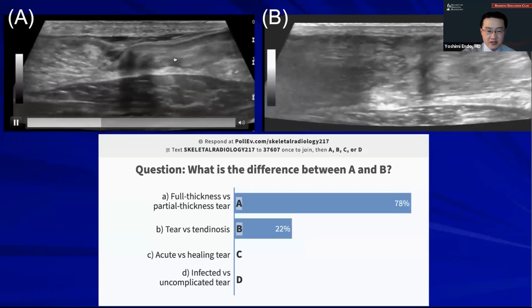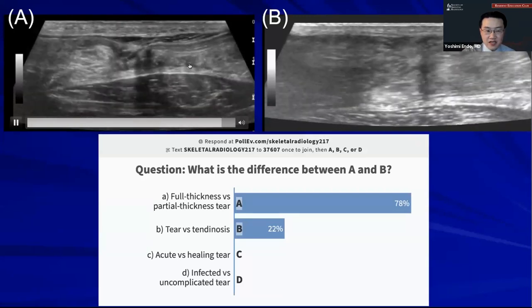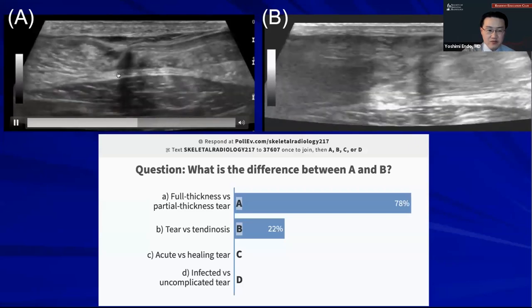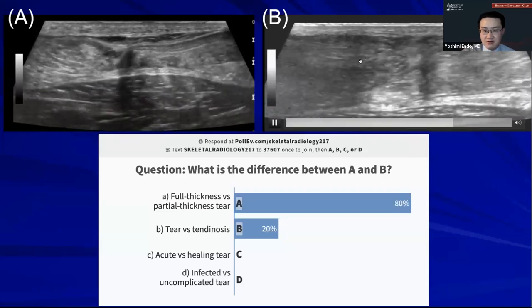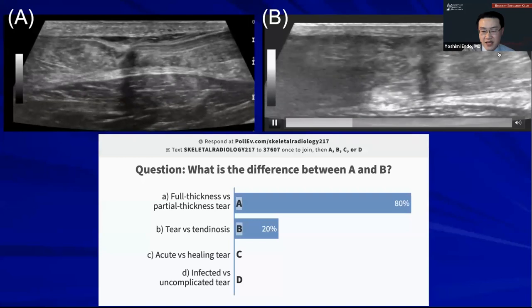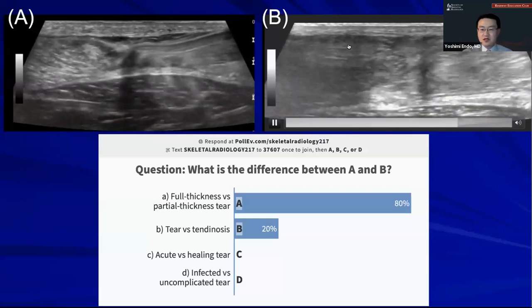This is the distal end, and this is the proximal end in this first video. When you apply tension to the Achilles tendon, you can see that this part of the tendon is moving independently of this one, because it's a complete tear. There isn't any bridging tissue between these two stumps. Now, this is a different patient, but we're doing the same maneuvers. You can see that when the ankle is being dorsiflexed and you're applying tension to this part of the tendon, this part also moves too.